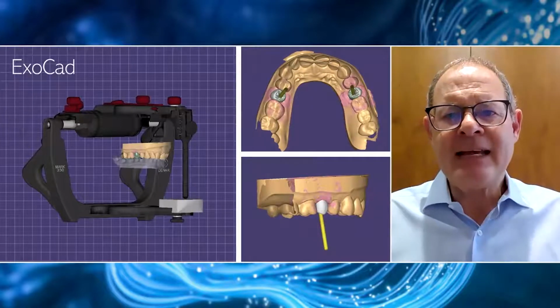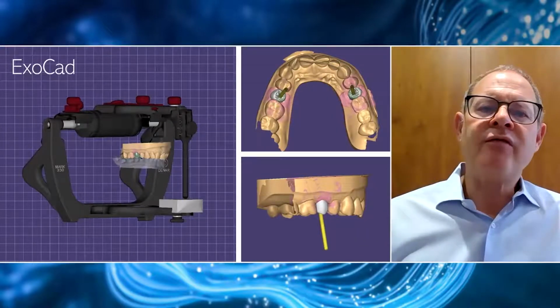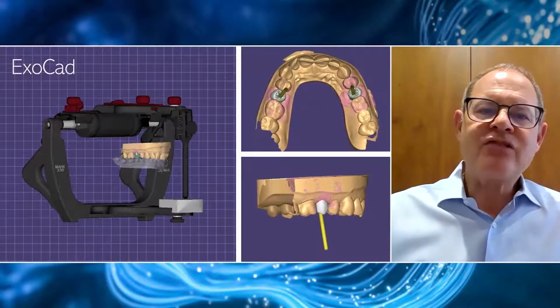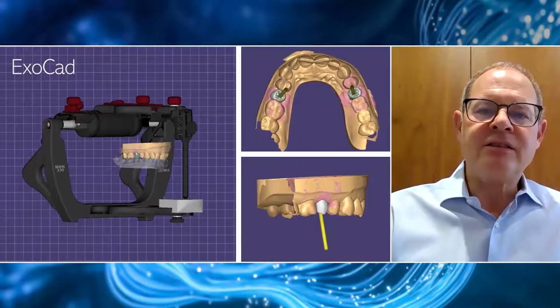And this really sort of completes the circle in terms of a digital workflow, because now the superstructures are themselves being milled from a digital design.